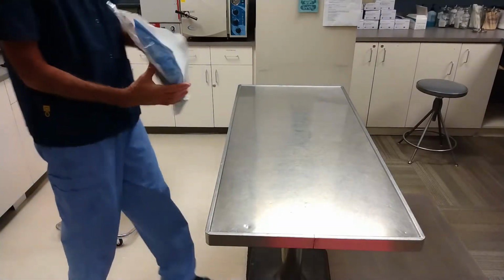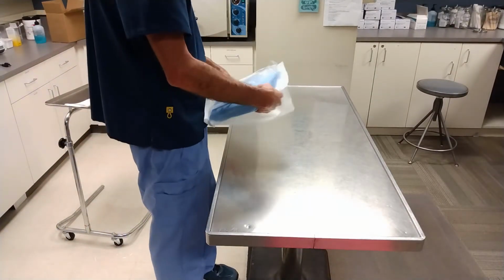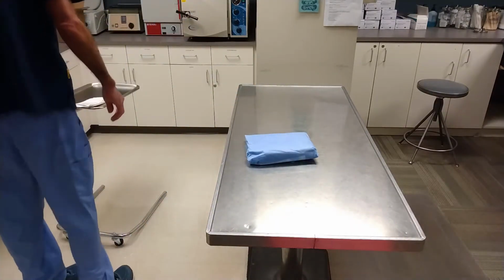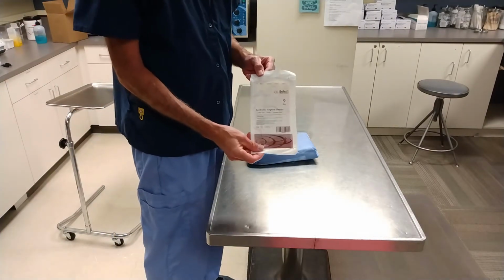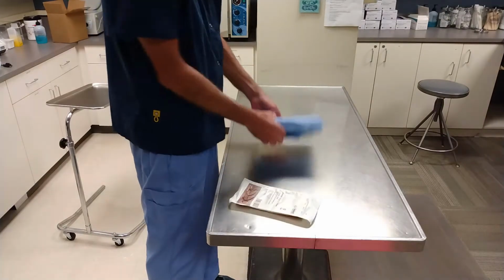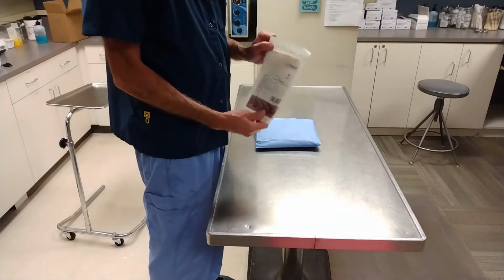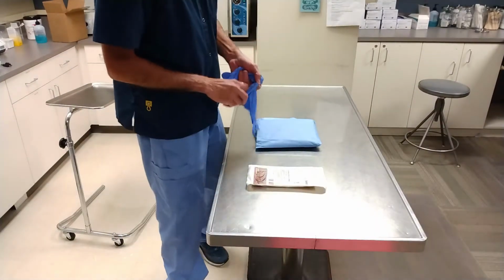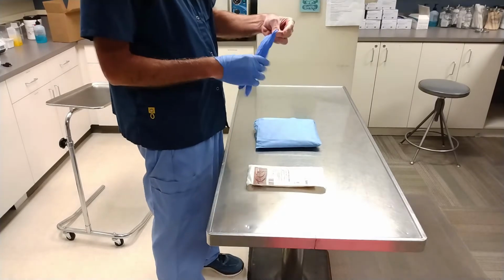Okay, gown package like this. They're pretty standard. Surgical gown. And then I have sterile gloves, right? So the outside of this package is not sterile, but inside it is. So I have to be careful about the way I open these. Remember, I'm not scrubbed in yet. I'm just preparing my back table.